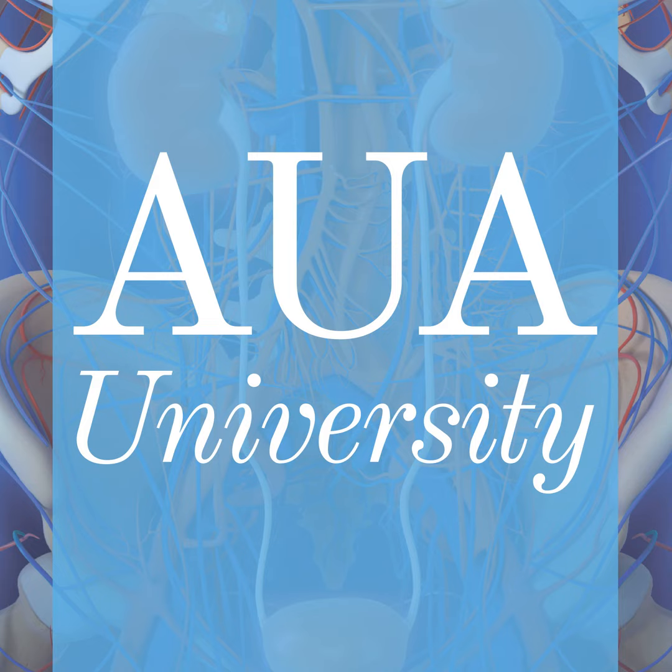If you would expect, for example, skeletal or visceral metastases, most probably you could do a conventional imaging or start patients immediately on androgen deprivation therapy. If you would expect local recurrence and your patient might be a candidate for some type of local treatment, then definitely a PSMA PET scan would be advisable.